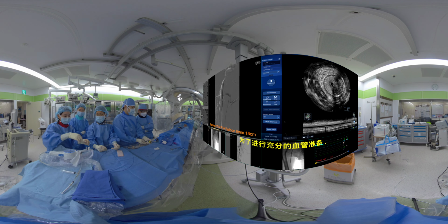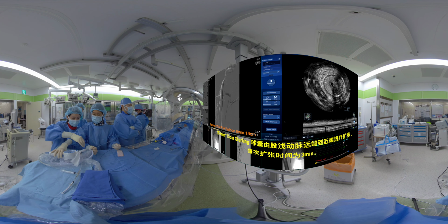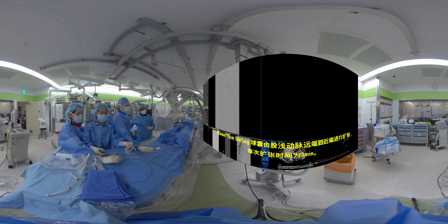For proper vessel preparation, a 6 millimeter, 15 centimeter PTA balloon was inflated from the distal to proximal SFA, 3 minutes for each session.